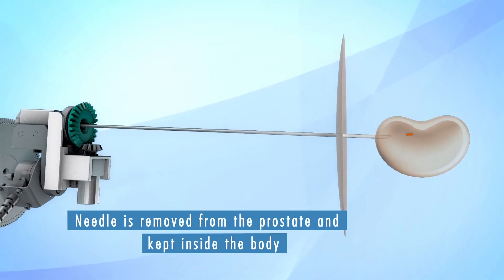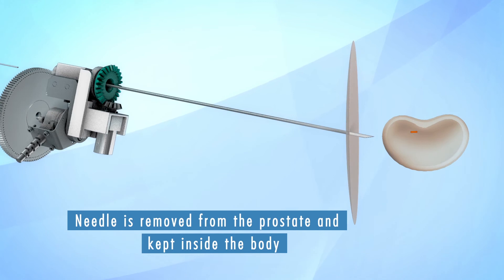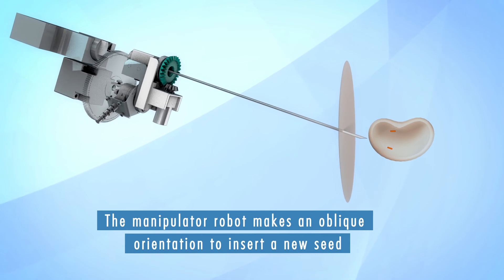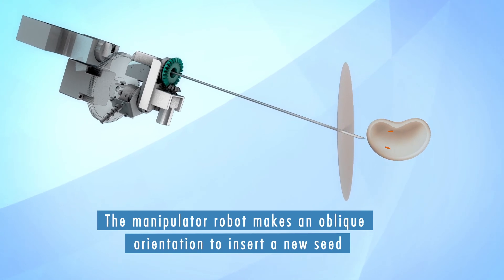Robotized prostate brachytherapy exploits the mobility of the robot operator for insertion from a single point of contact through the perineum to reach multiple targets using one needle in the prostate.